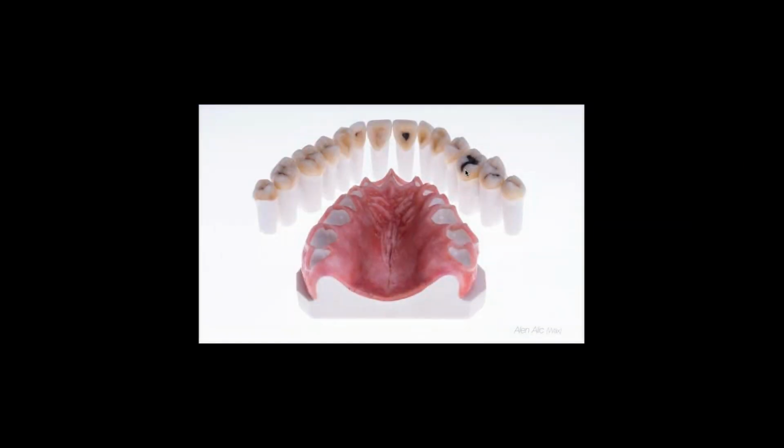Here you can see that I like to do the Geller model, and I like to copy nature and present it with wax. It's a cheaper and easier way to do such hyper realistic copies of your upper jaw, for example. But first of all, to do something like this, you need to practice a lot.